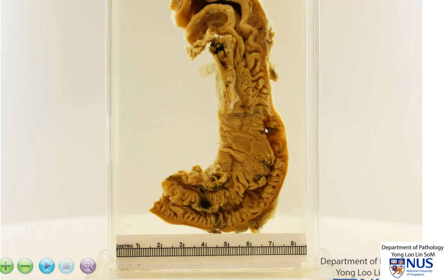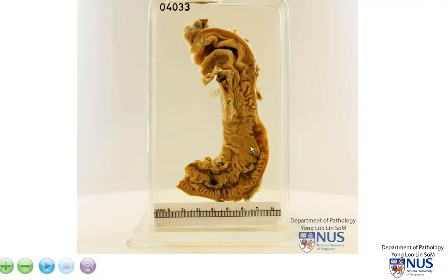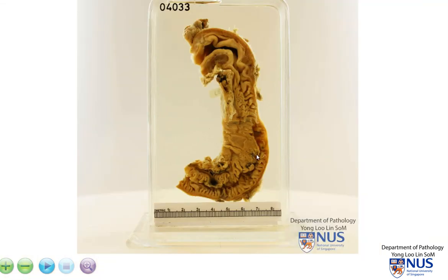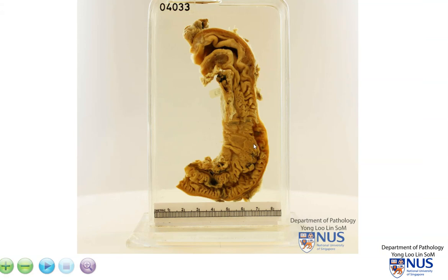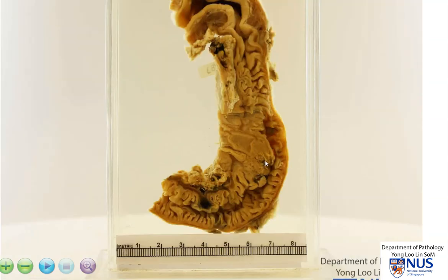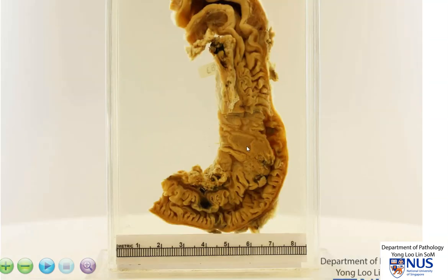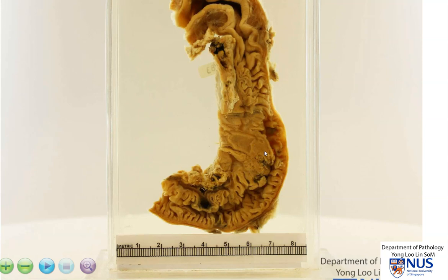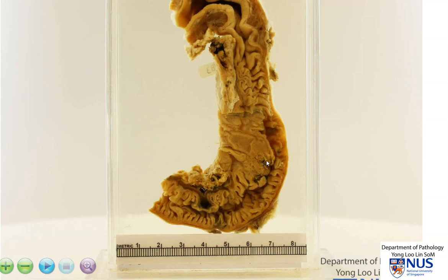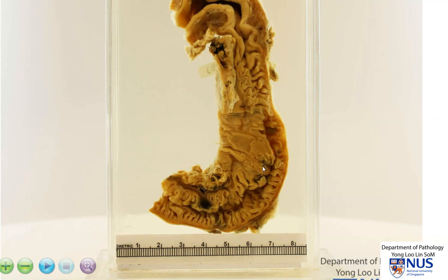In summary, this is an example of carcinoma of the ampullary region, where we can see a tumour mass that is arising just at the part where the common bile duct is joining and opening up into the duodenum.